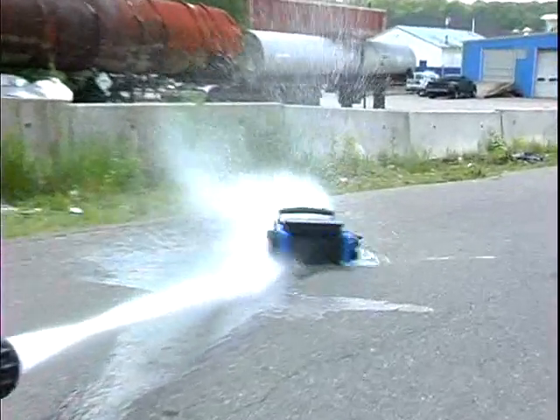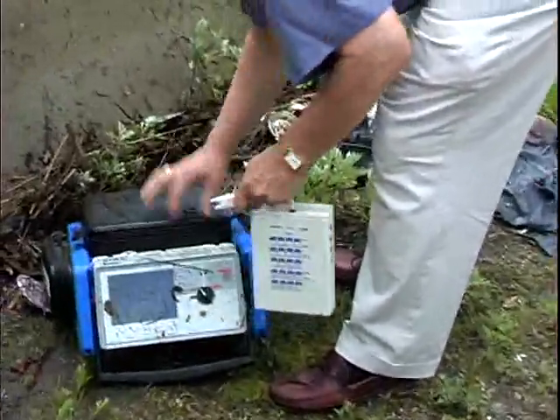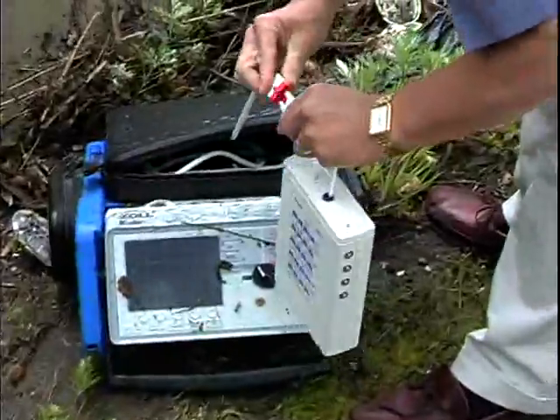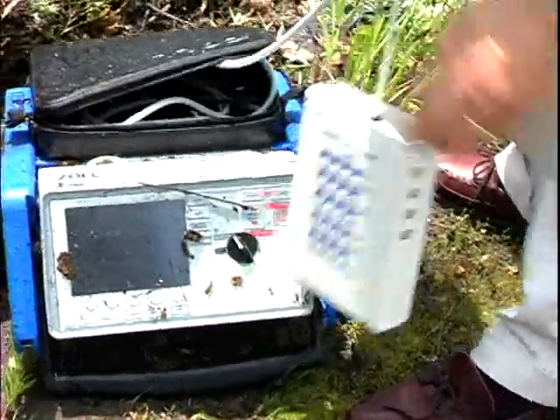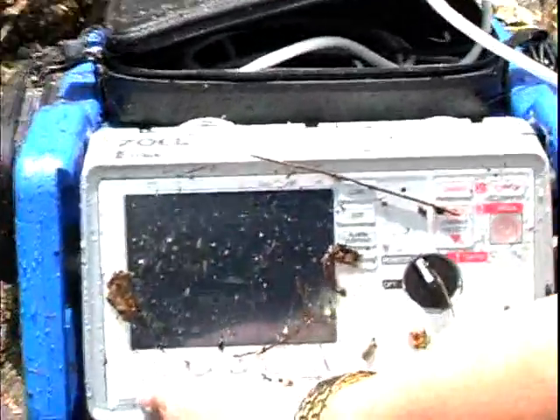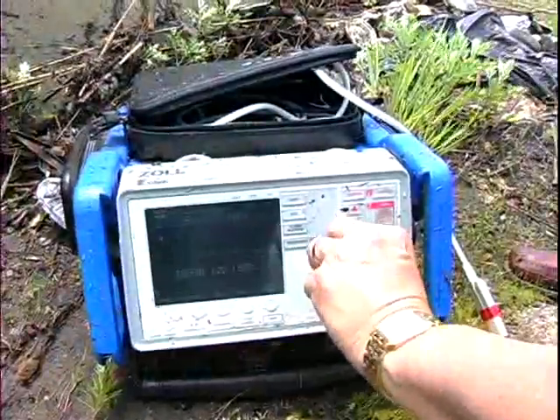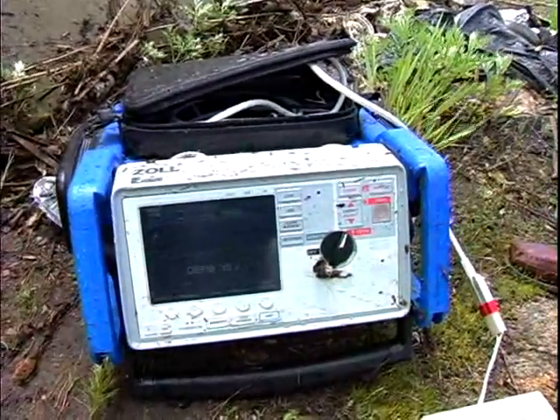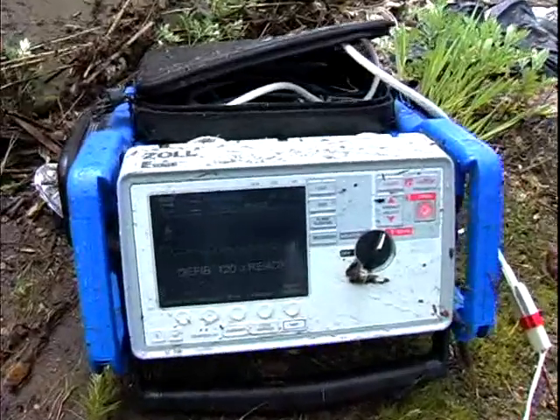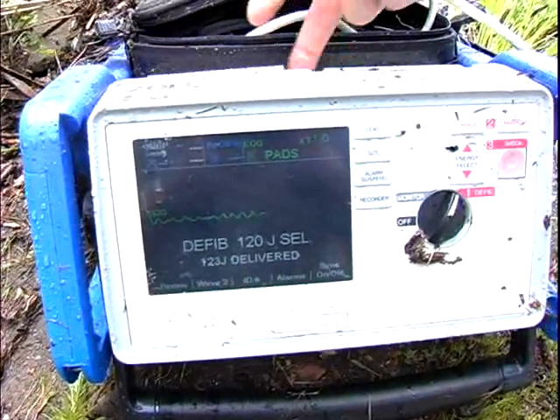We had a local fire department come to close-test the E-Series to see how it would withstand a high-pressure washing. It did a good job of spinning the E-Series across the parking lot into an abutment, but as we hooked it to a simulator and turned the device on, you can see the tri-mode display. It truly is easy to read in any environment, taking a pretty good beating from a high-pressure fire hose, then charging it up and delivering 120 joules. The obvious occurred — the paper got wet.